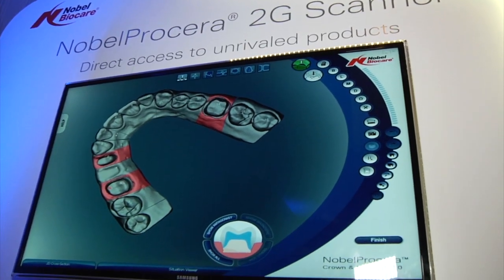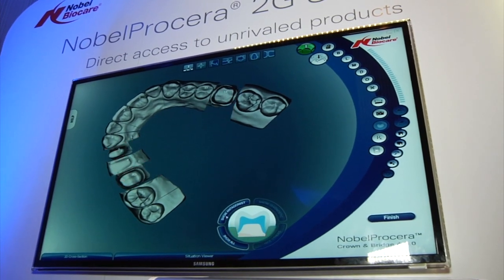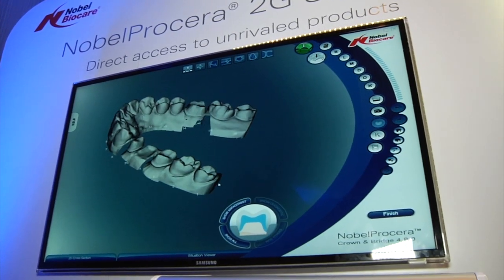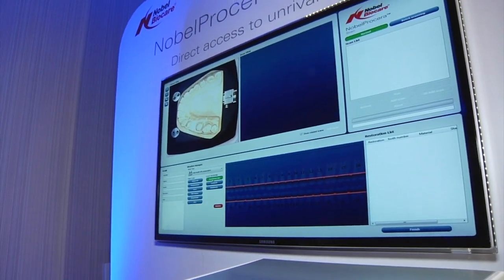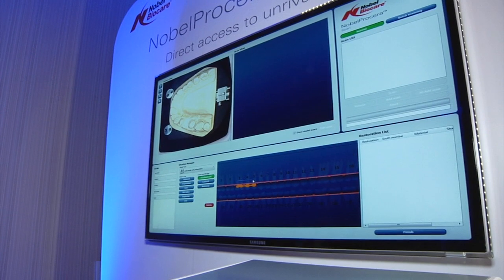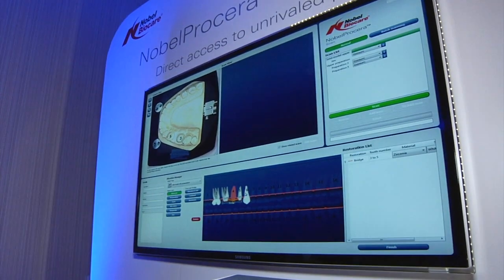Here you can see an example of a solid model scan. We've digitally segmented it and identified tissue and preparations, separating these out into different meshes. The ability to scan a solid model and construct crowns, bridges, and coping restorations into this workflow is now a reality with the 2G system — something that simply wasn't there with the 1G.